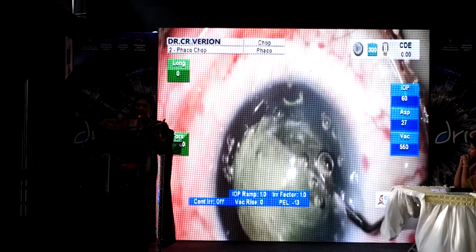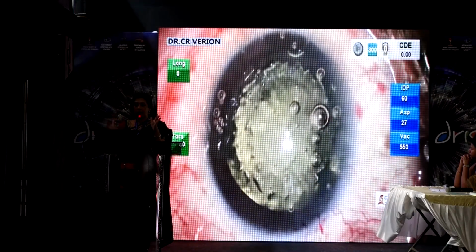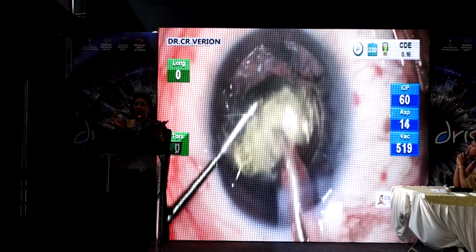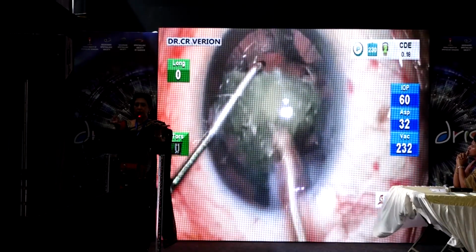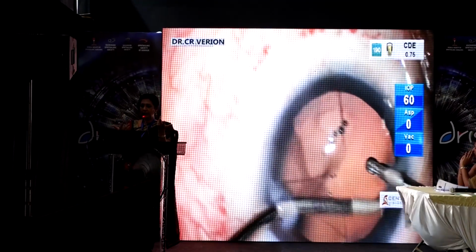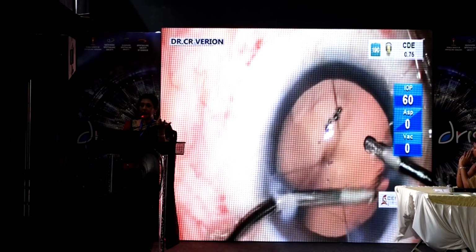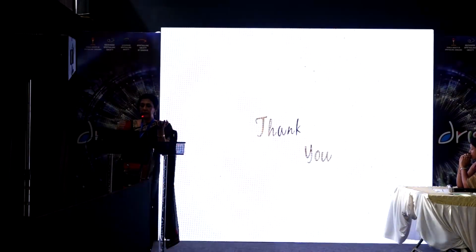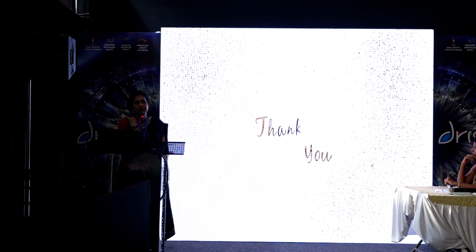You should ensure that the parameters on the phacoemulsification are not very high, there is not too much pressure in the anterior chamber, and enough viscoelastic is placed. But again, incidentally, much to our luck, this was a very soft cataract, and with all the grid softening, it was like just carouseling out the entire nuclear fragment. But you can see there's a rhexis extension, sub-incisionary. Thankfully, the surgery was quite uncomplicated, but that was an area which gave way because of the hypertrophic scar of the RK, and thus the surgery got done.